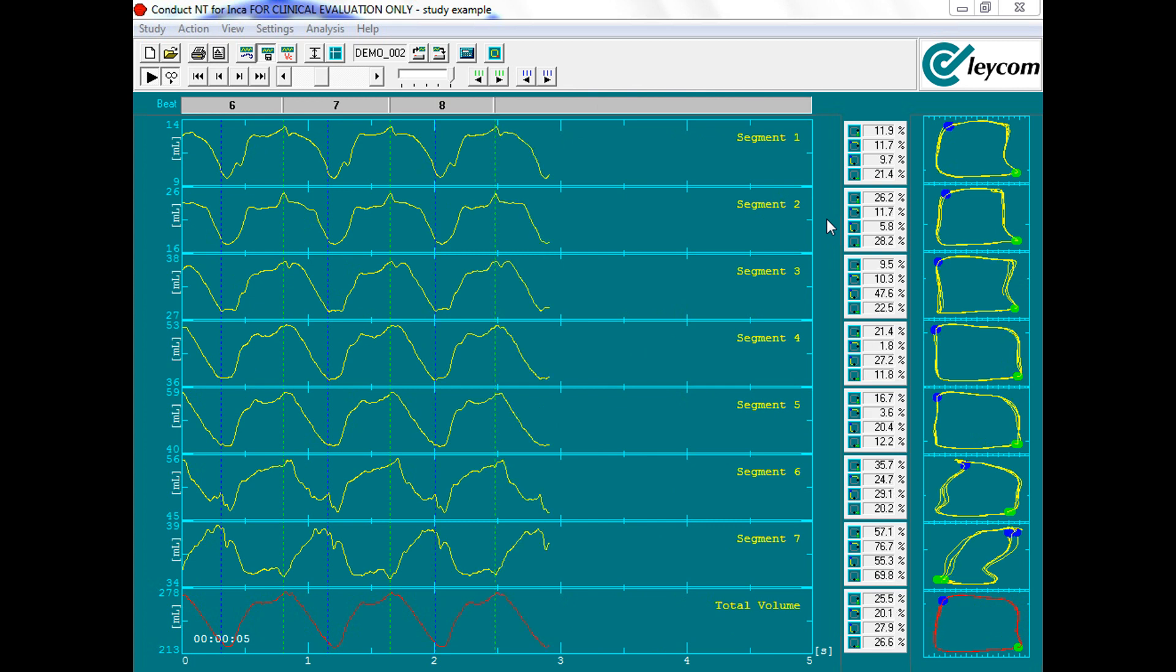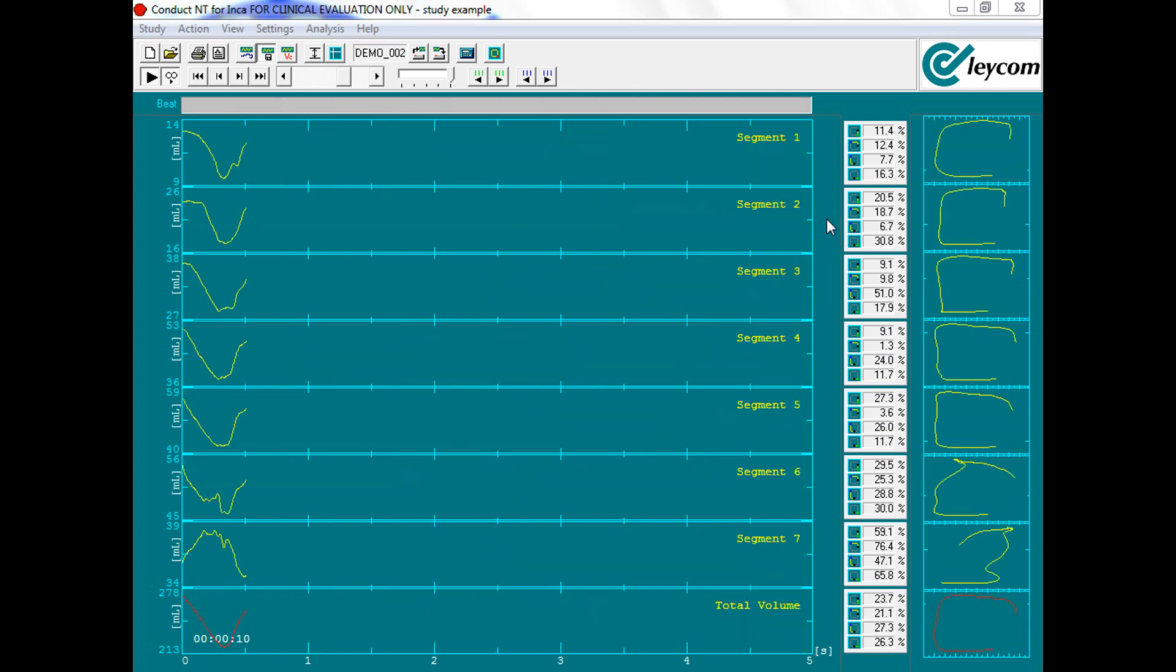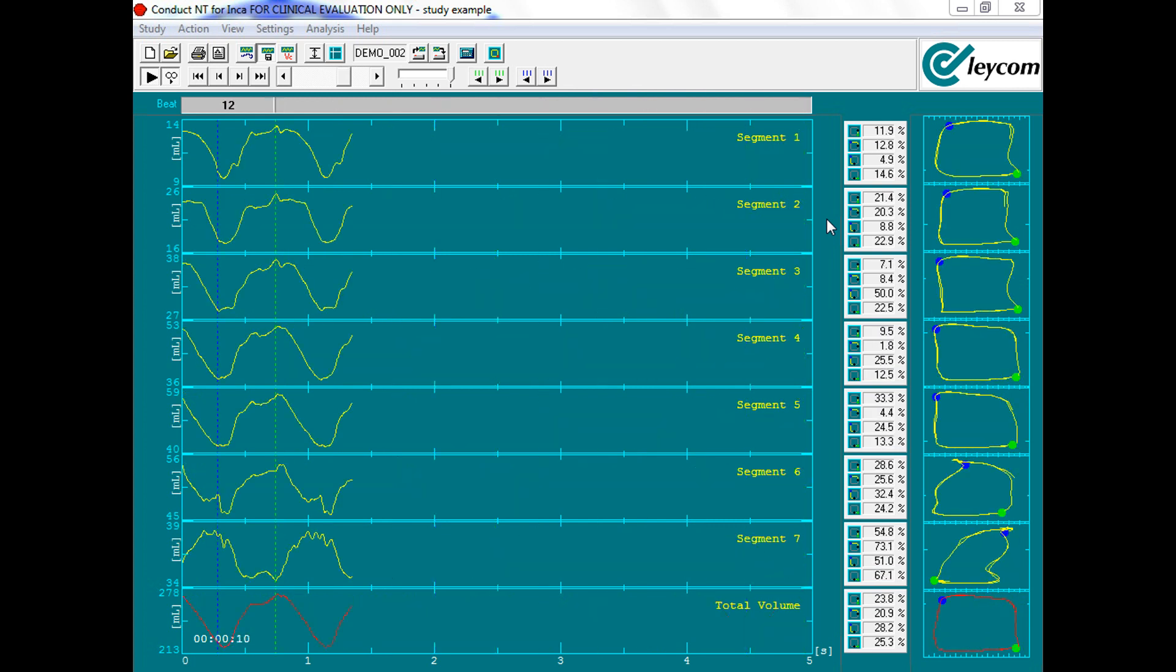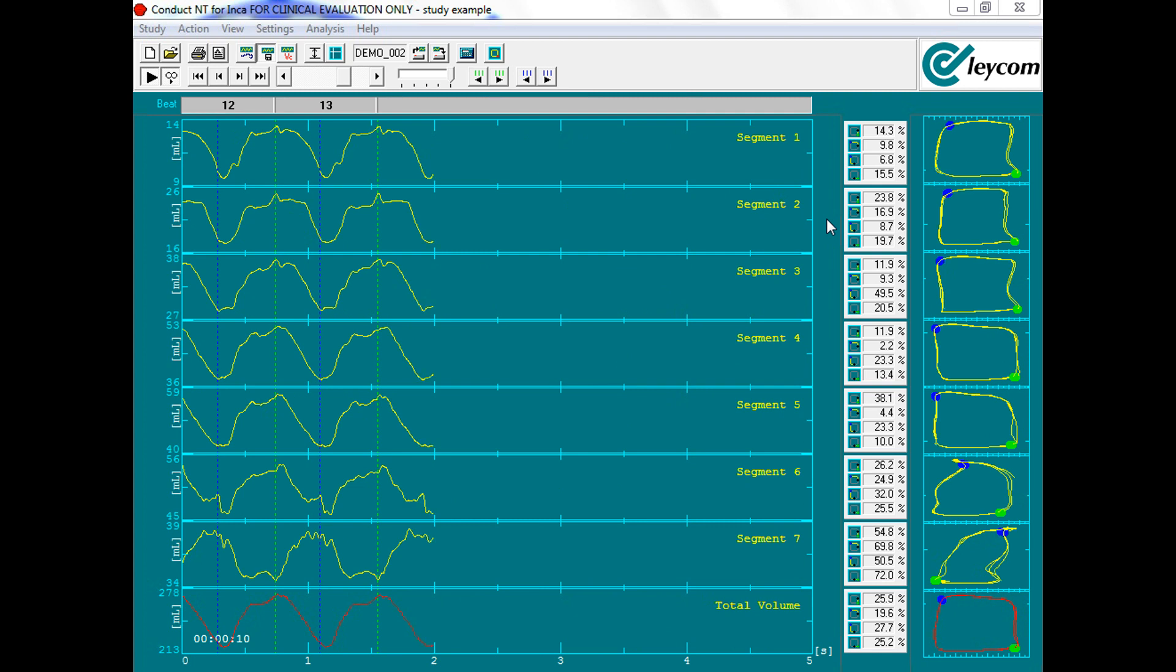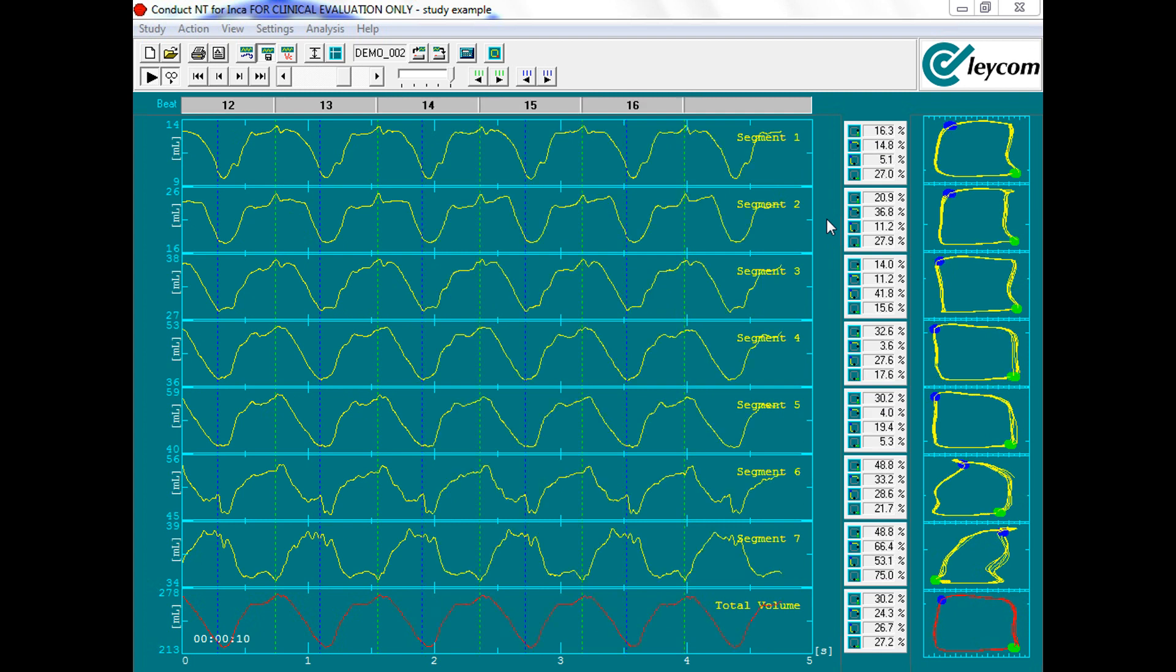Data quality is directly related to catheter positioning, thus it's highly recommended to optimize this position before continuing with the intervention.